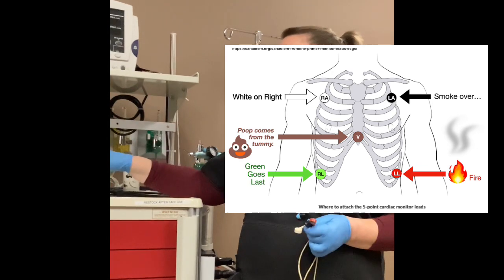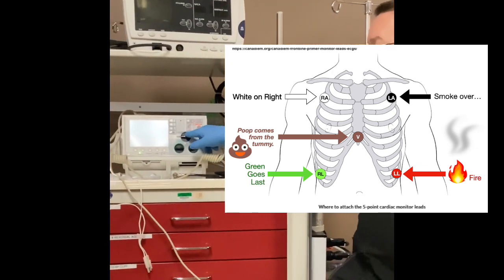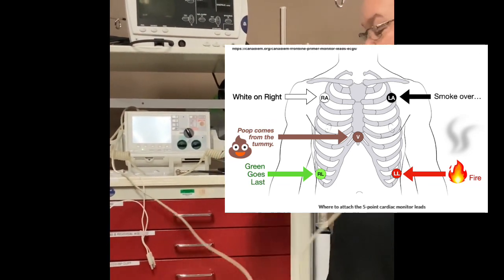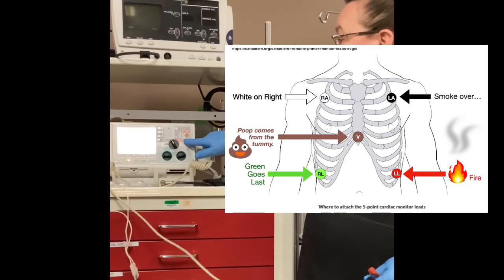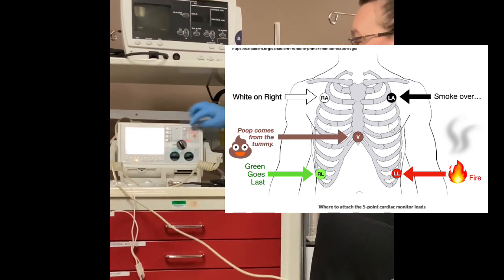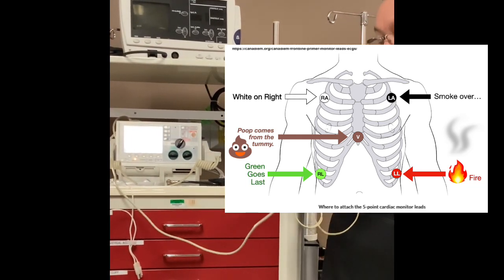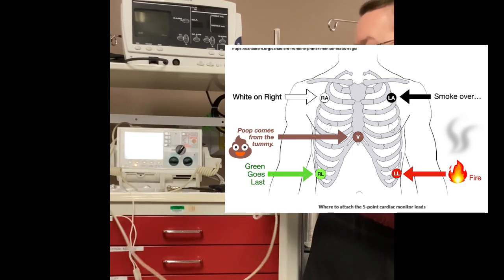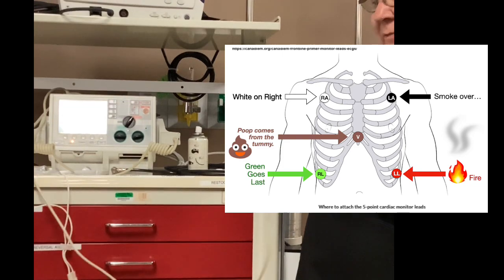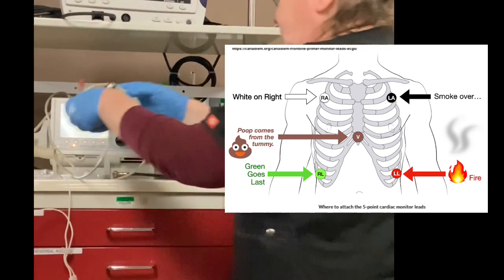And then this will come on, and what happens is if you need to defib somebody, we turn this on. I don't have it hooked up, so it's not going to show. But let's say this was a rhythm and we wanted to defibrillate the patient. Then we click over here to defib. So what rhythms need defibrillation? We just talked about it. Defib, not AFib. VFib needs defib. The patient doesn't have a pulse. Is it an emergency? Yes, it's absolutely an emergency.